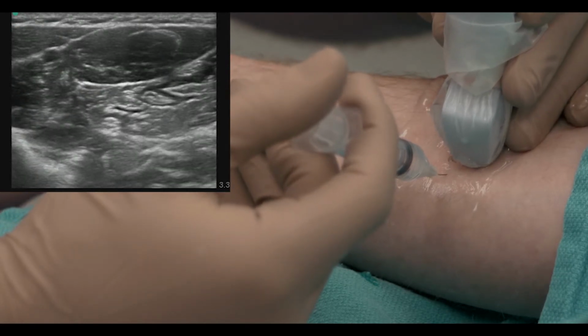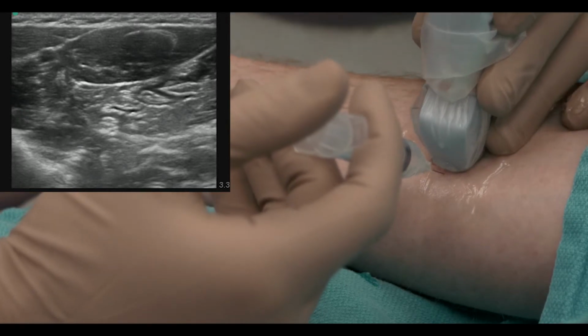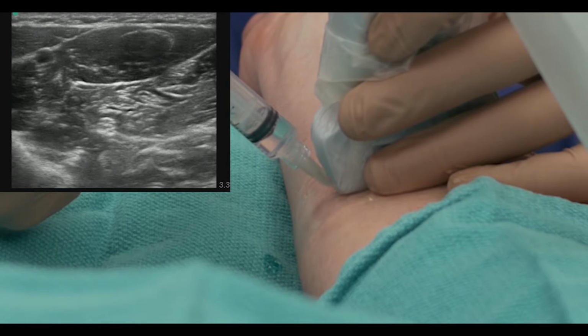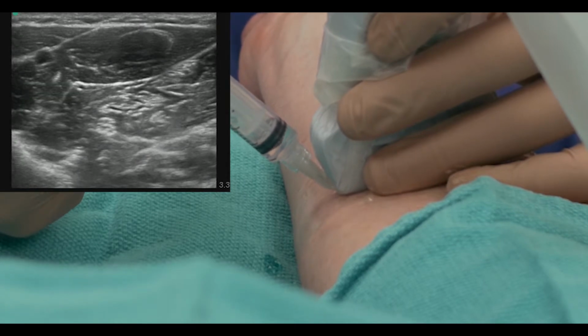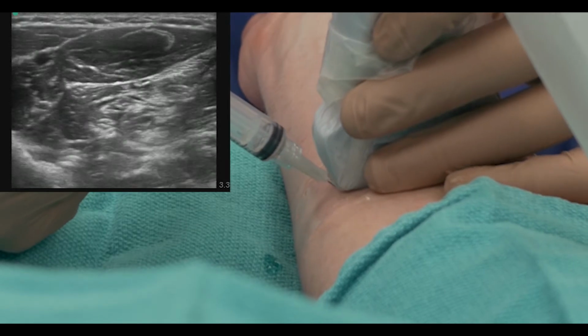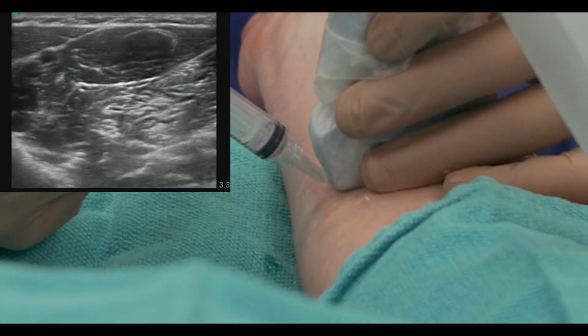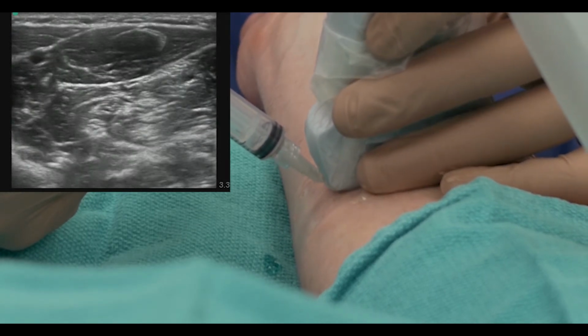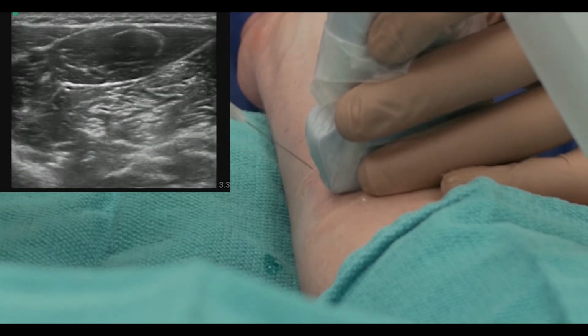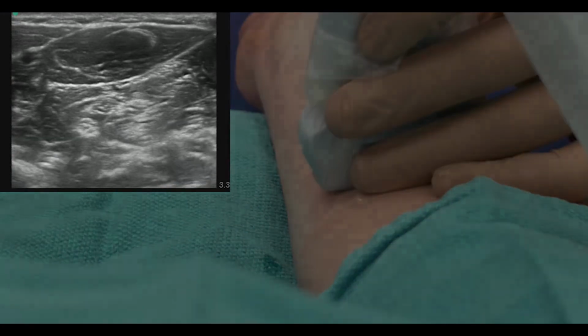And so then from there, we're going to move the needle again. I'm going to come a little bit deeper this time. You can see it moving distal. And we see that fluid going all the way around the nerve. Once that's completed, take the needle out, and then within probably about 5 minutes we'll start to get some anesthetic effect.